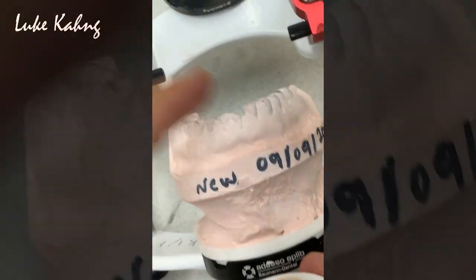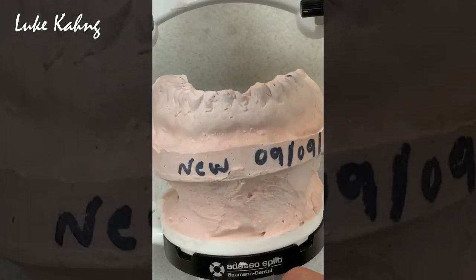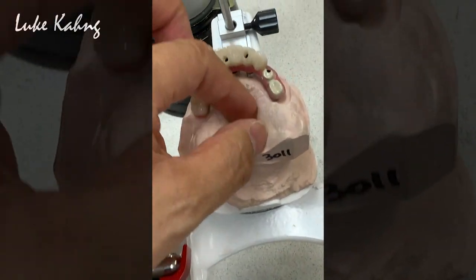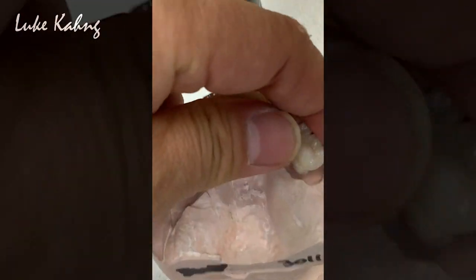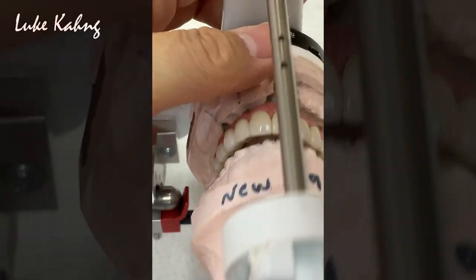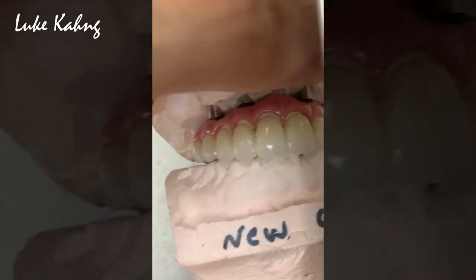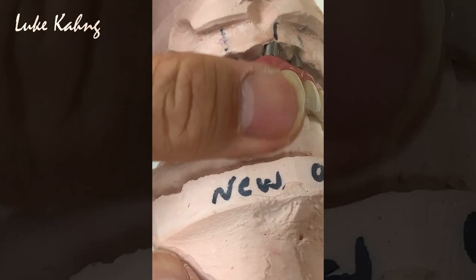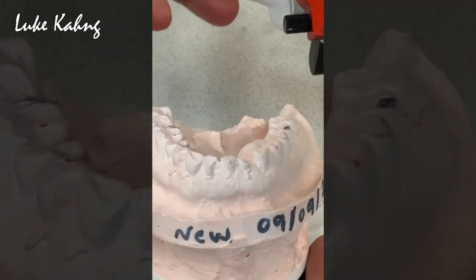We have to increase the vertical dimension, but we're going to make the night guard as well after we print this. And you can get this, it opens the bite here. So we get the good occlusion contact here, also there, okay? Now, we're going to increase the vertical dimension with the night guard. Unfortunately, we have to make the entire open bite because the lower is almost demolished.